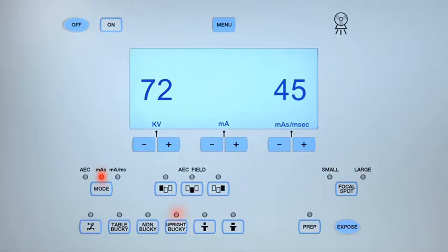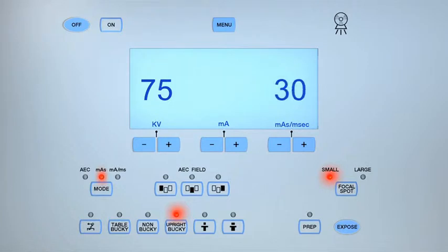Select the upright bucky setting and the small focal spot. Set the exposure parameters between 70 and 75 kV and between 6 and 10 MAS.